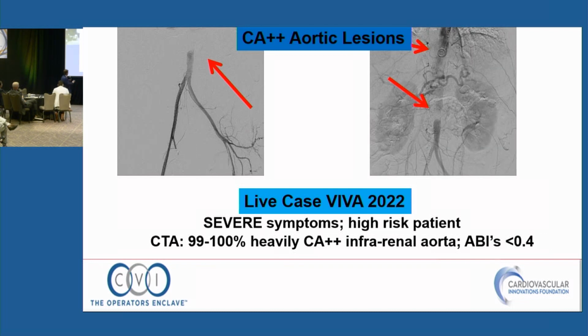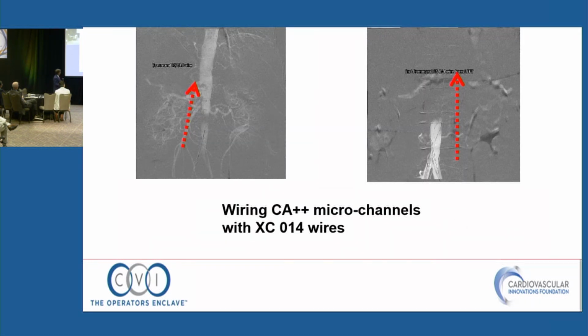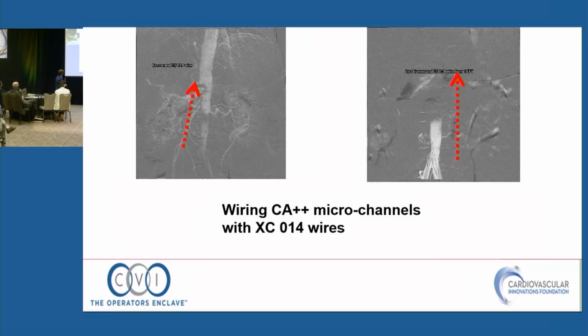Good calls all the way. Just for time, I'll move on here a little bit. One of our groups was trained down here in Texas with Carlos Timaran. He looked at the case with me, as did the world, as we were watching Viva with vascular surgeons. So here's the microchannel 014 from both sides. We've got triple access.